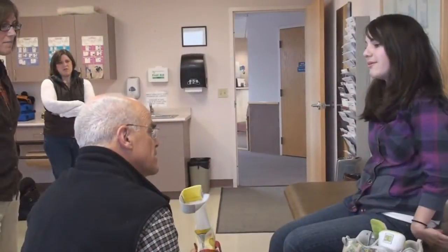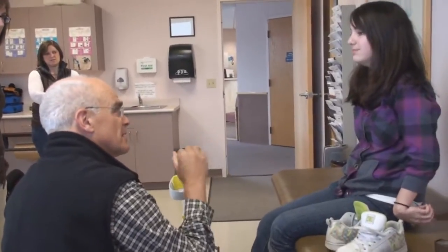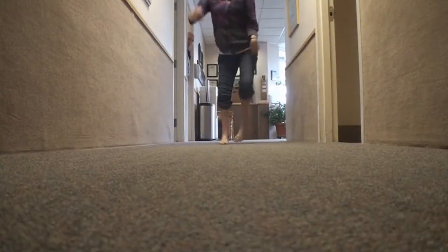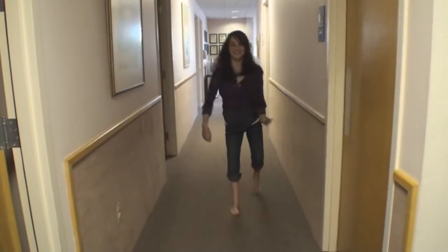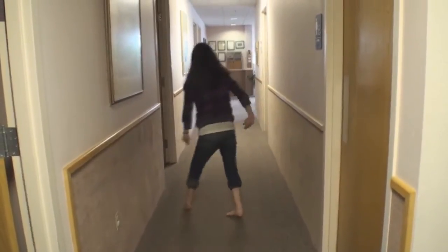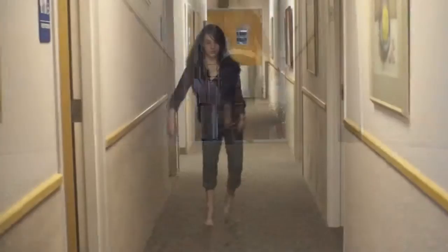We offer a lot of different styles. The most important single factor or process is, in fact, determining the correct amount of bracing for somebody. How much stability do you actually need to be functional? Not too much, not too little. We really choose a style of brace that allows as much motion as the patient can manage.